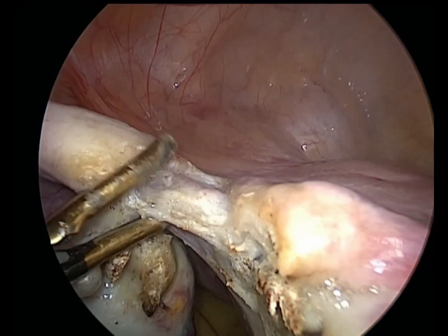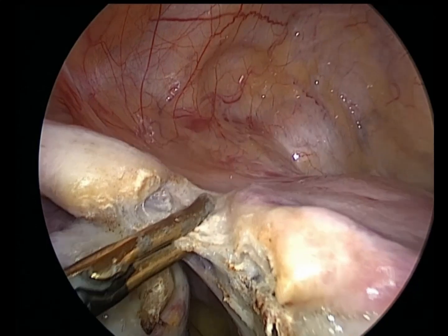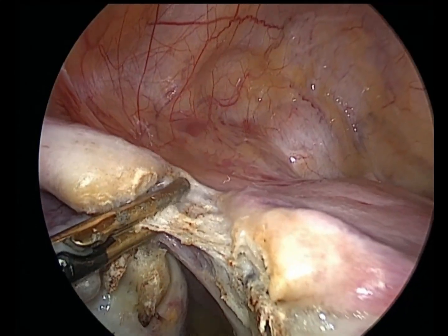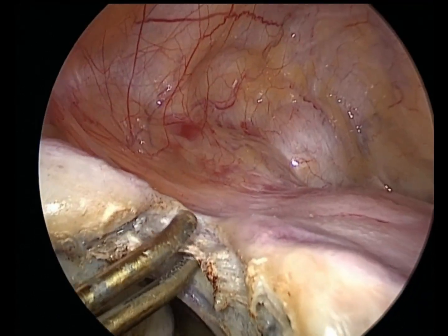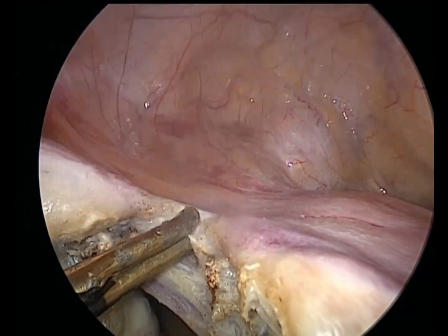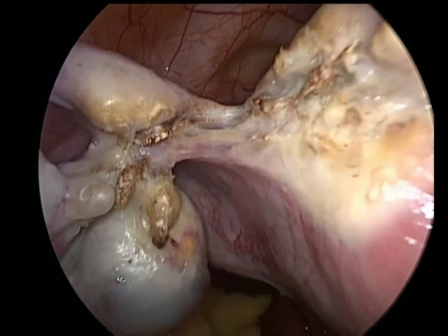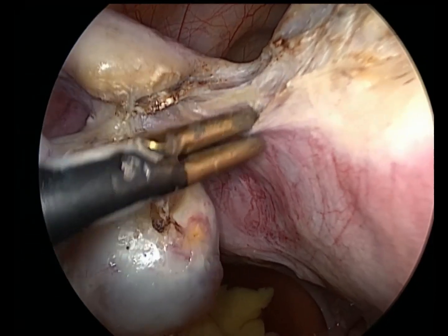Do not go very close to the uterus. Stay a little bit away from the uterus so that you have something to coagulate in case of bleeding. Now we will coagulate and cut the posterior layer of the broad ligament.